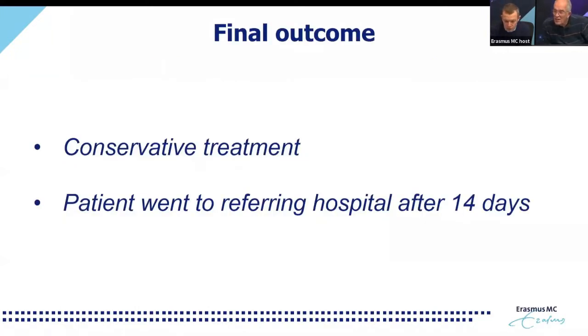Would you consider using a cutting balloon at the distal edge of the hematoma to release it? Yeah, that's a very, very relevant question and a potentially very practical solution to this problem. The use of cutting and scoring balloons has been reported in patients with dissections. But again, at the end, we don't put stents or any other material in to treat hematomas. The reason is that stents are meant to treat narrowings due to atherosclerotic disease.